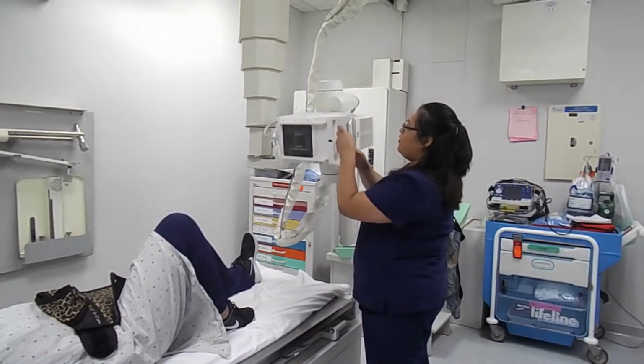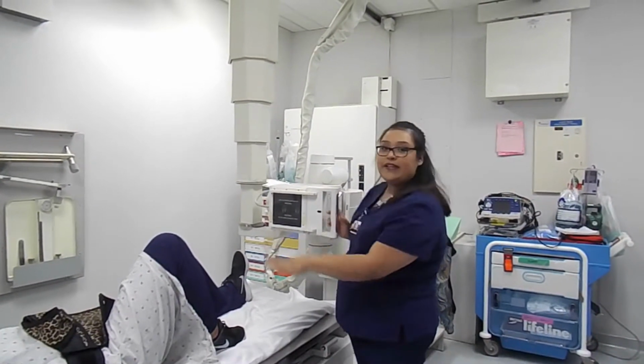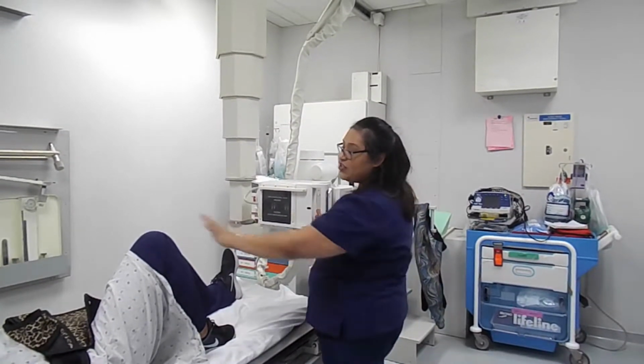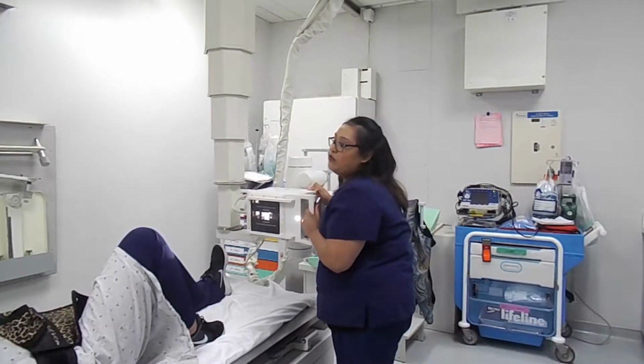And then we're going to be using a tube angle based off of the flexion of the knee. And our center ray is actually going to be entering the patellofemoral joint.